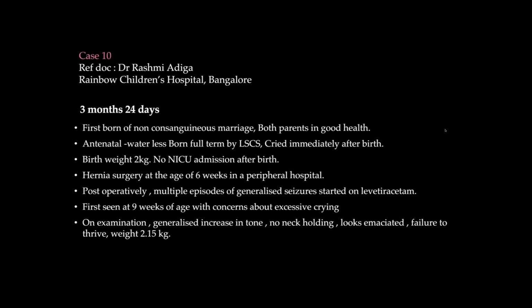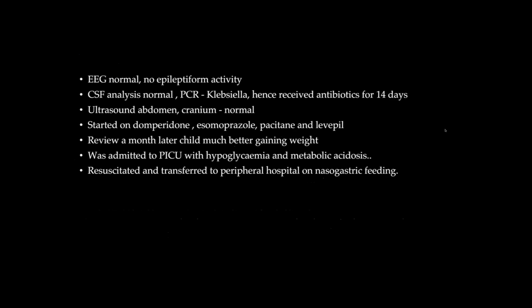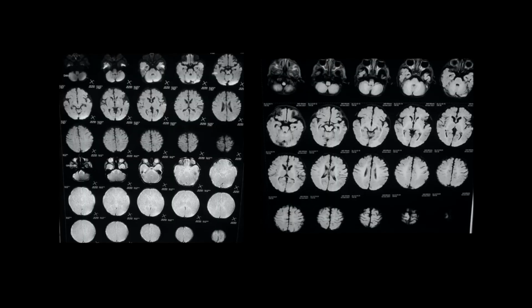Okay, that's helpful because at least we know that with the MRI, there is no hypoxic injury. So I can tell them that there is no hypoxic injury. I would say that the imaging handle is pretty weak for this case. That is my conclusion. But no definite changes of hypoxic injury, at least the hypoxia related change at 6 weeks post-birth.